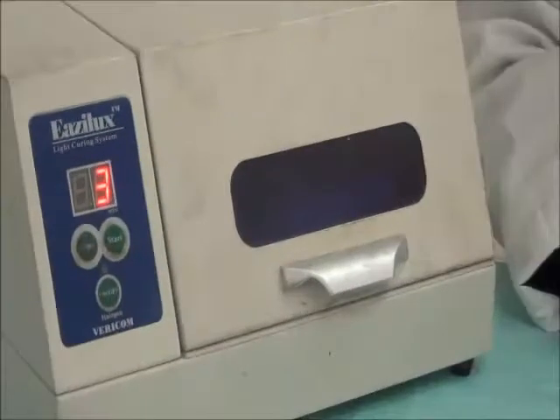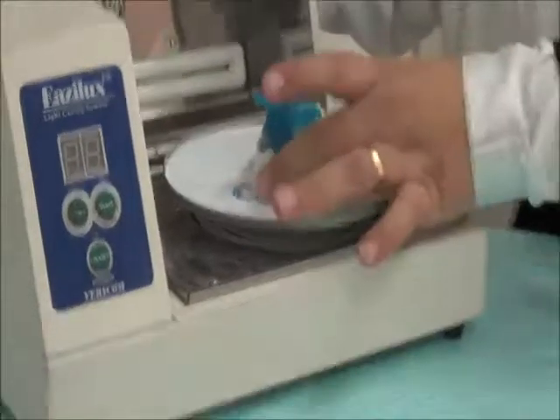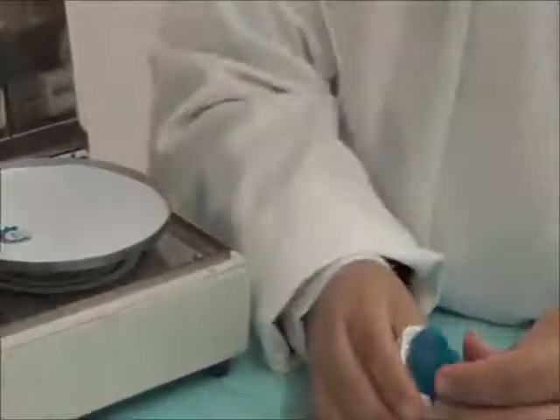Now that the first cure has finished, we're going to remove the tray and separate it from the cast.